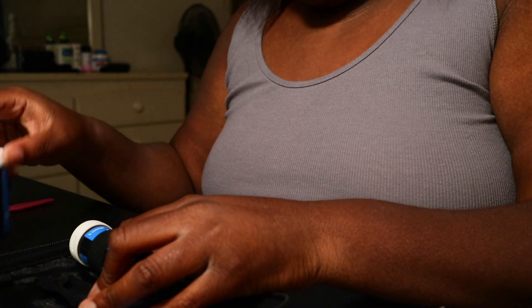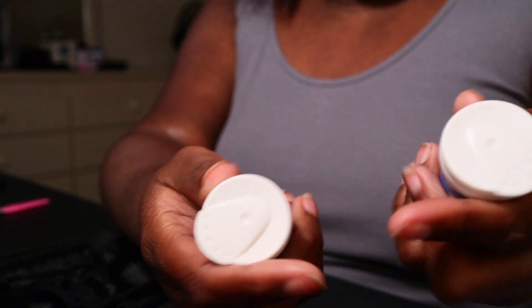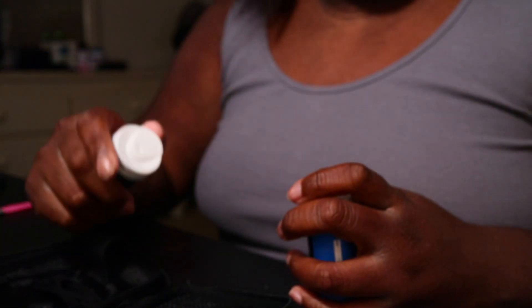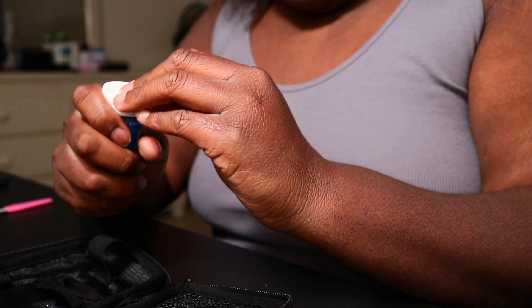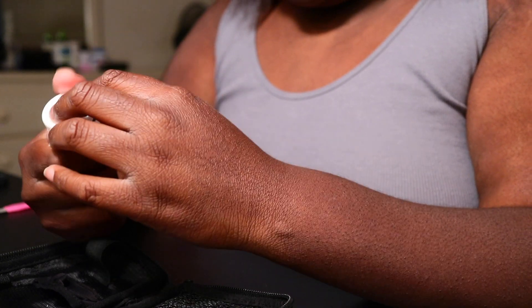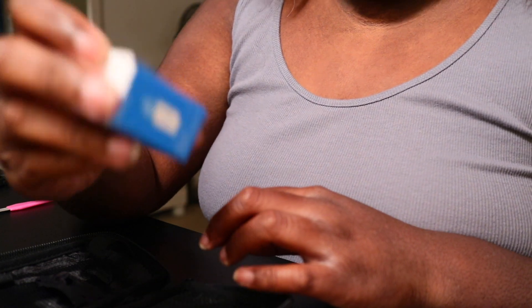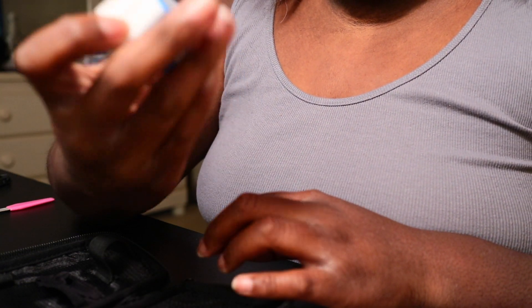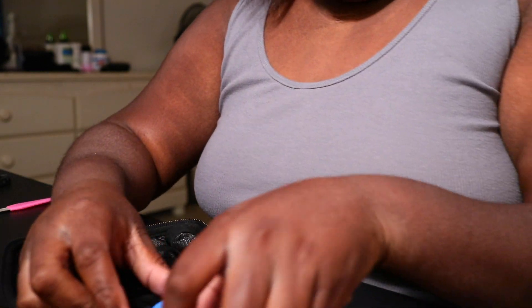And then you get two extra things of test strips, so you do get free unlimited test strips every month, which is not bad for how much test strips go for. And then you got some little control drops to make sure they still work. That is everything.